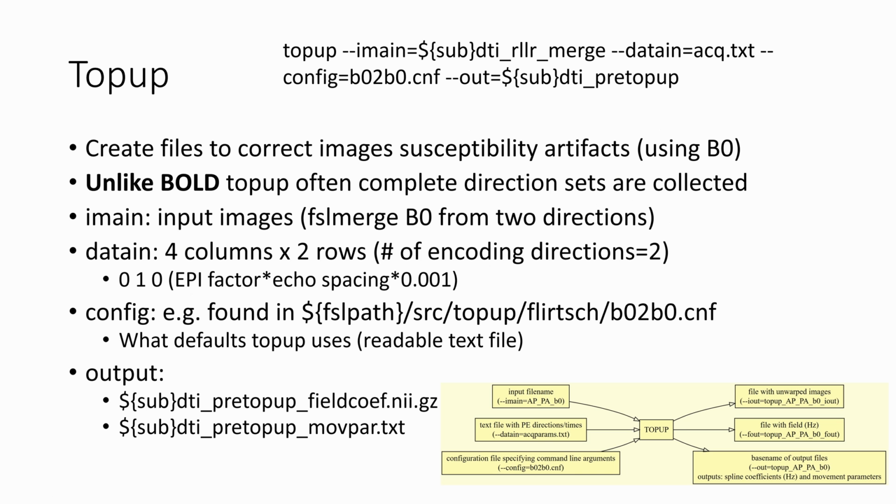Okay, so top up, and I'm going to go through this relatively quickly because I think most of the time that you're using the multiband you can get the top up done, and the top up script, like a lot of the FSL scripts, are written for a Siemens scanner, and there's some translation that needs to be done to move more quickly onto the GE scans, and that's thankfully done without any direct influence.